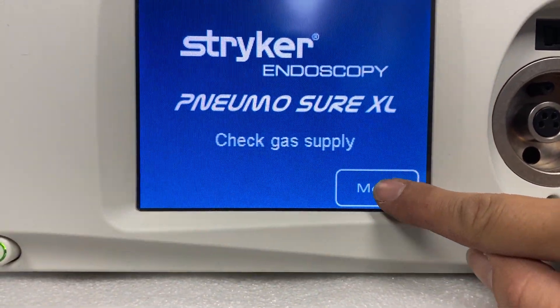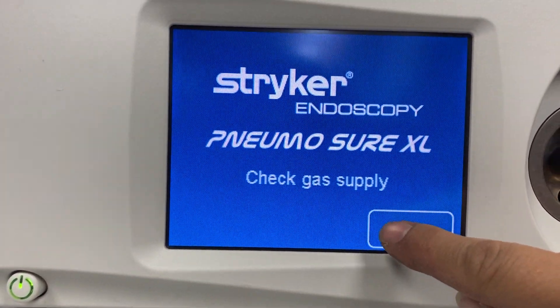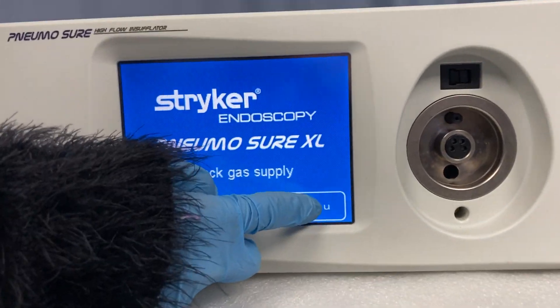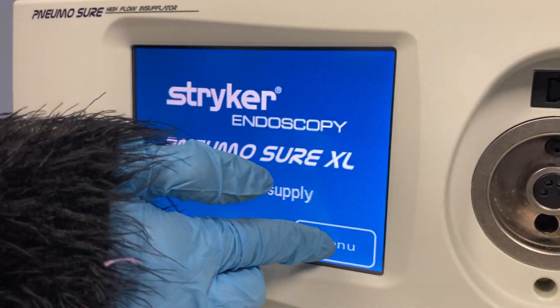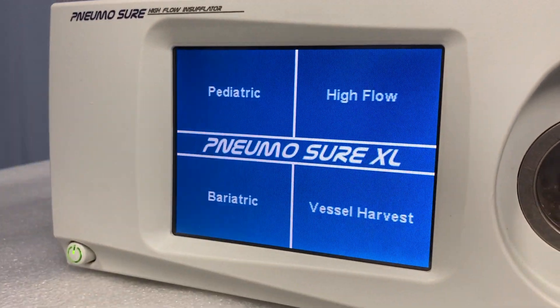I'm just hoping now that the screen will actually switch after a certain number of clicks maybe. I'll get my colleague to try as well. There we go.